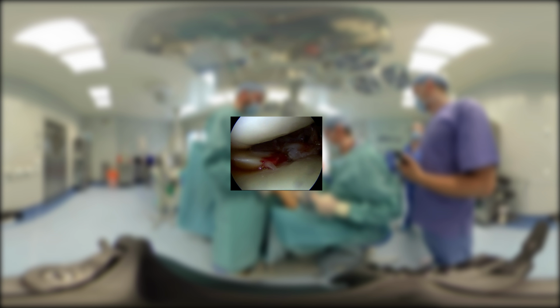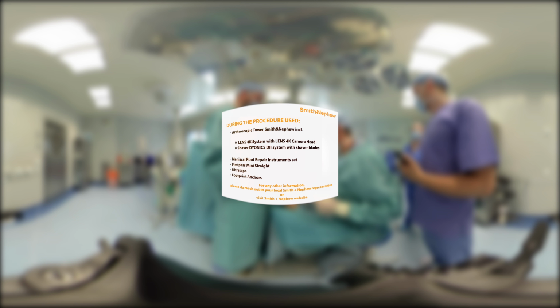The meniscus is visibly stable in the tunnel and well attached. This is where the procedure ends. Thank you very much.